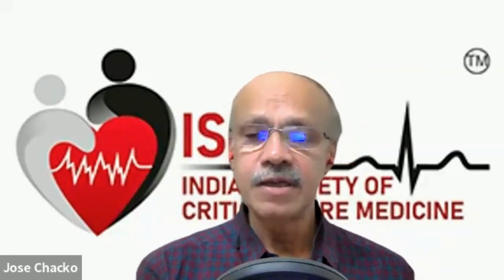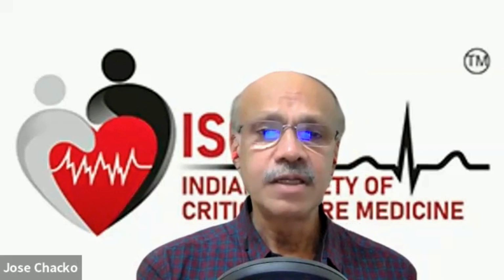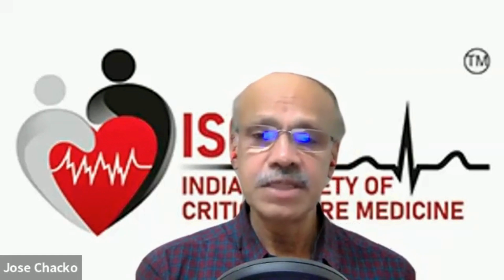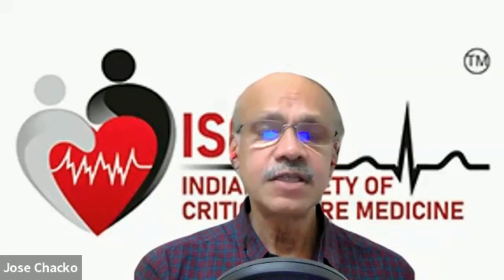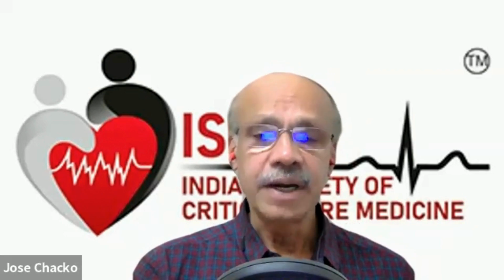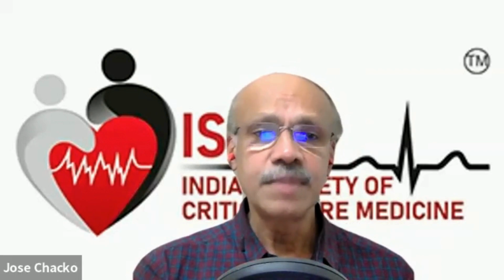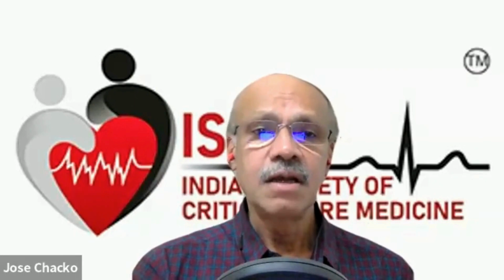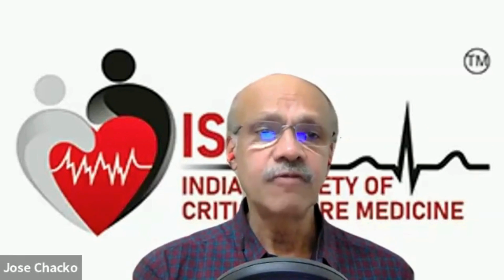And we're all familiar with the McConnell sign, which is apical sparing when there is right ventricular dilatation in acute pulmonary embolism, although it is not specific for acute pulmonary embolism. So these are some of the features of acute pulmonary embolism by the bedside in a patient in whom you strongly suspect possible pulmonary embolism. They may be immobile, with fractured limbs, and in bed, highly susceptible to clot formation.